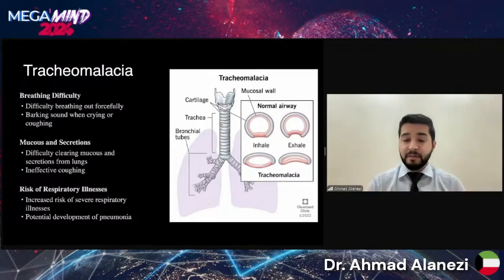This is especially important when we are designing our denture, because the denture can accumulate some of the mucus, and the patient reported that his previous denture accumulated mucus and gave him coughing attacks. Those coughing attacks sometimes developed into respiratory illnesses and pneumonia.